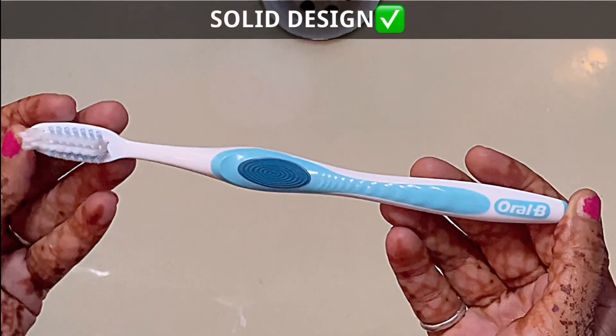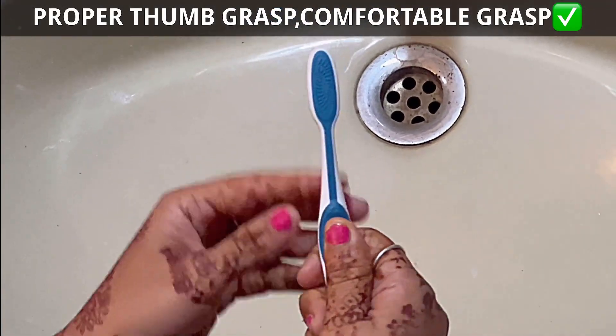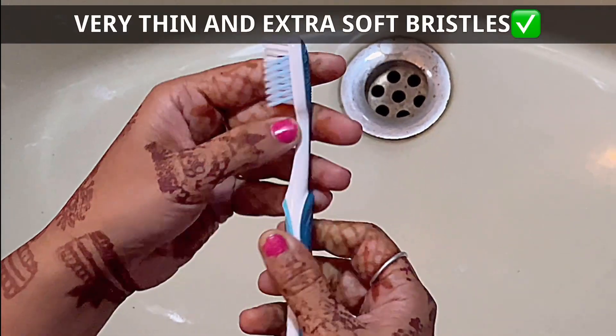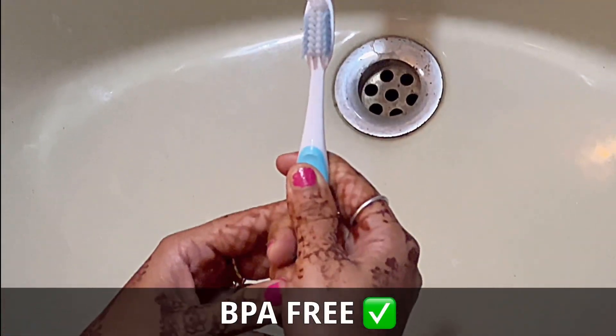This is how it looks. Oral-B badging. We get a thumb grasp and the reverse side looks good. This is the tongue cleaner. Bristles are quite soft and I am sure this will serve the purpose. The neck is slightly stiff and this is how it looks.